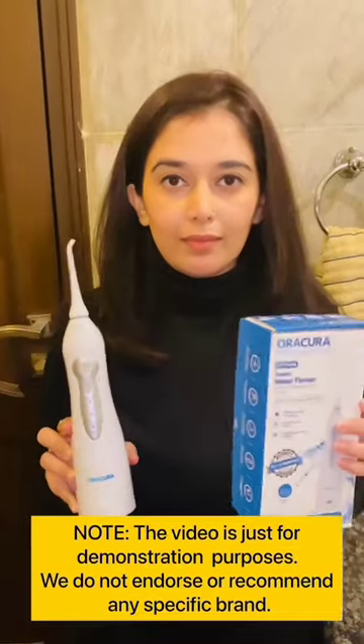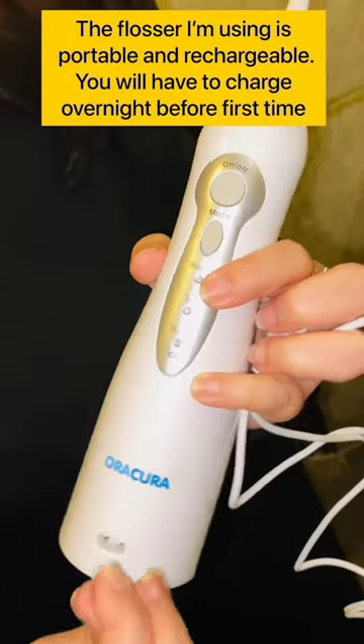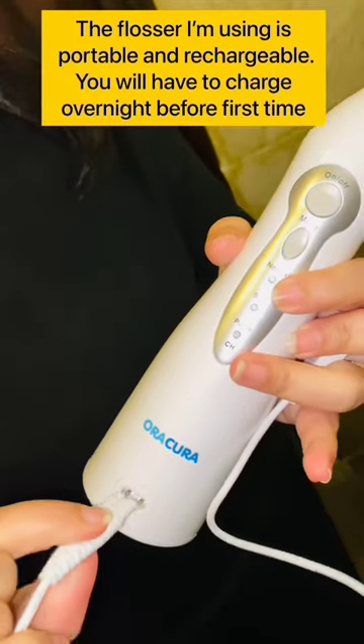How to use a water flosser without making a mess. I'm using the one by Ora Cura. It is portable and rechargeable. Charge overnight before first time use.